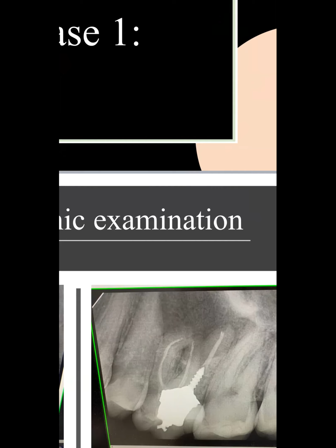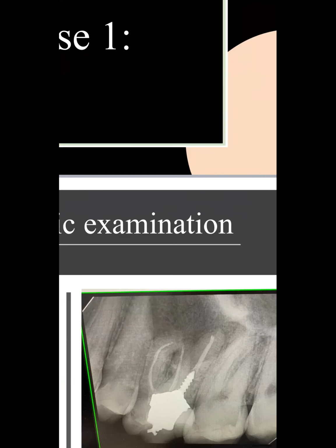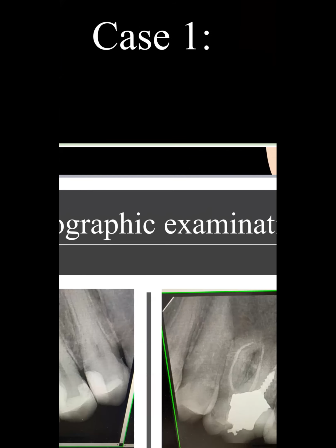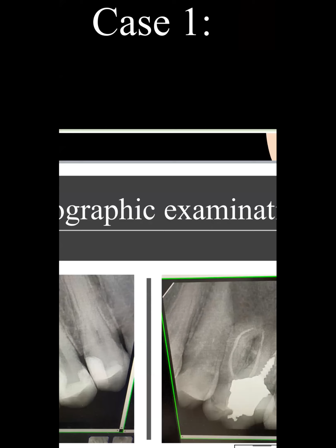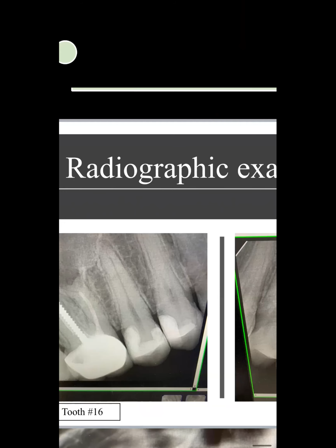Should I go over them? I think if you can just give me a good general idea, what was the question that people maybe did not answer correctly? Okay, the main one, which was close, was which lesion causes the teeth to appear as if they're floating in space?